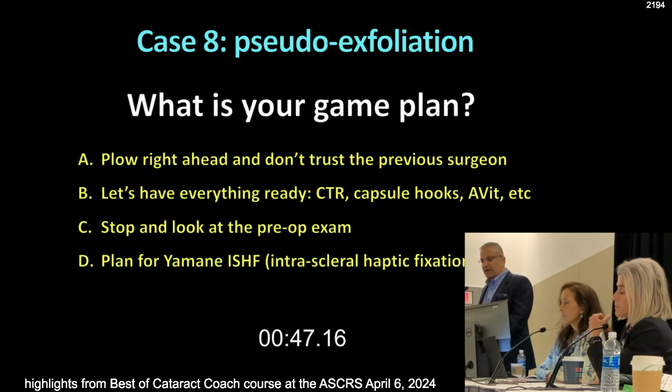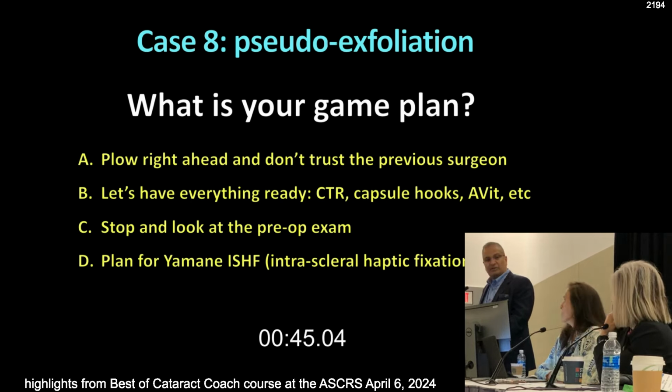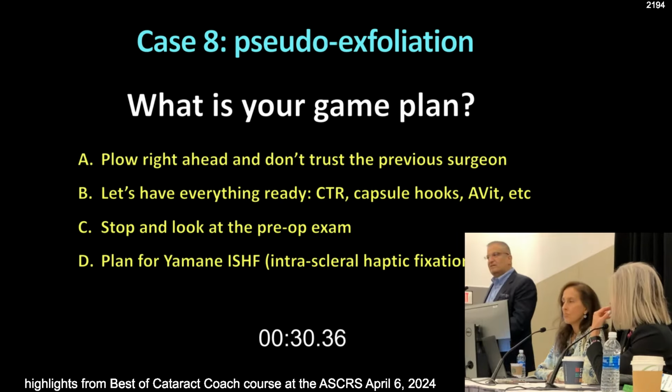No prior surgery other than the patient was taken to the OR for cataract surgery about a month ago, and a pupil expansion ring was placed. Surgeon then decided just to abort and took the ring out. No other surgery, just the incision. The patient has a paracentesis, a main incision, and evidence of a prior pupil expansion. What's the axial length?